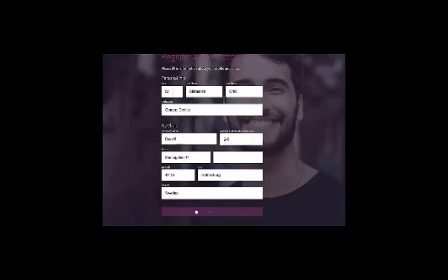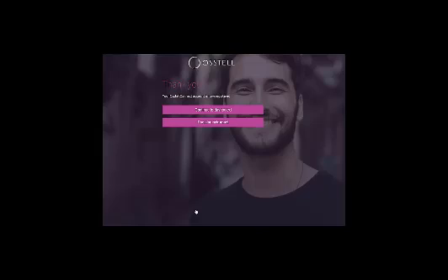Fill in information about your profile and clinic. This will improve your content on your dashboard. You'll be able to compare your clinic with data averages from other Osstell Connect users around the world. Click Register Instrument to go directly to your own device page.